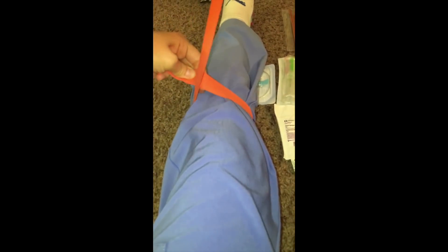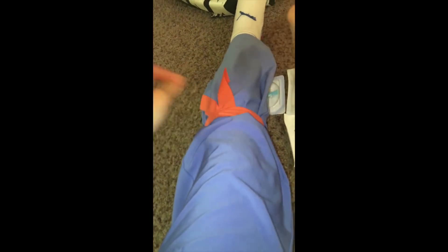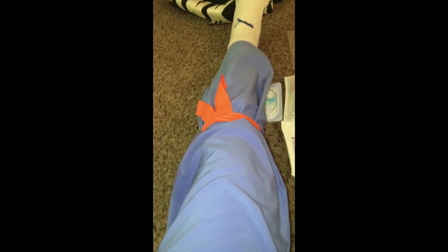So what you're going to want to do is take the tourniquet around the arm, stretch it out like that, put the top over to the bottom, and then tuck it under like that. The key is that tying it this way allows you to quickly release it — see that? So once you reach that stage in your phlebotomy draw, you'll be able to push down on the vein and feel it push back up on you. It's amazing — it's going to be spongy. So then it's time to actually pull out your tools.